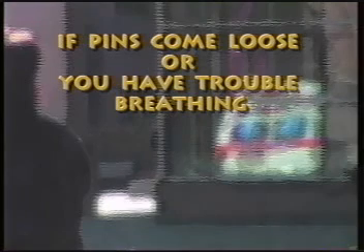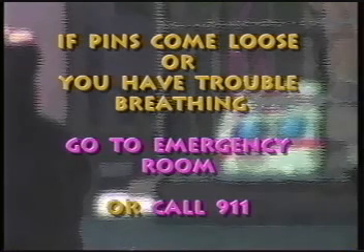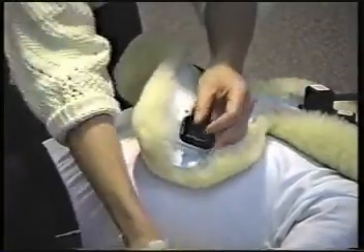In an emergency, you will need to take special precautions. If your pins come loose, or if you have trouble breathing, go to an emergency room or call 911 for help. In a medical emergency, the side waist buckles can be released, and the vest can be folded back at the crease to expose your upper chest. Emergencies are rare. Your main concern is to prevent infection at your pin sites, and to use common sense to prevent falls and injuries while you become used to wearing a halo brace.